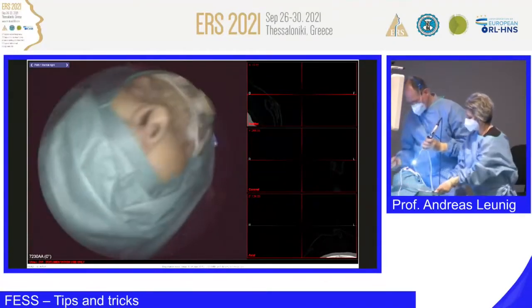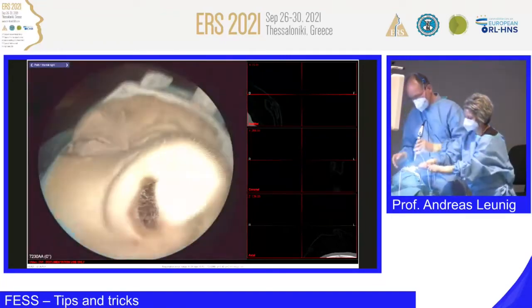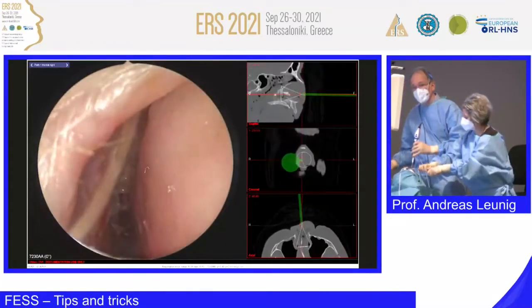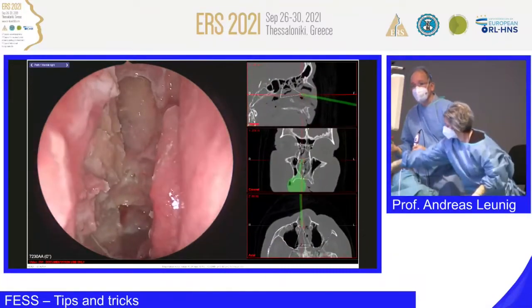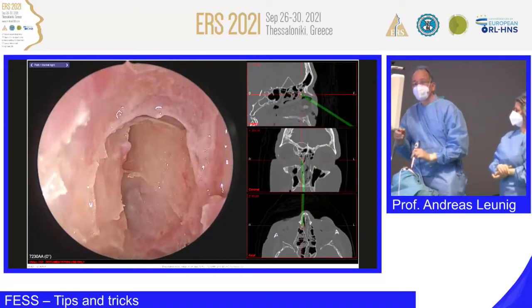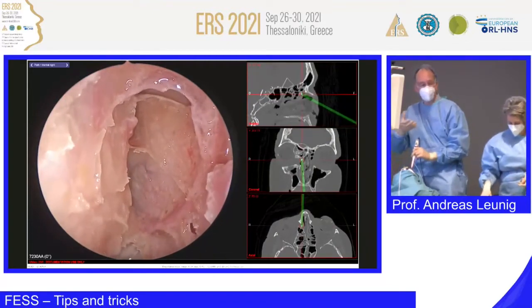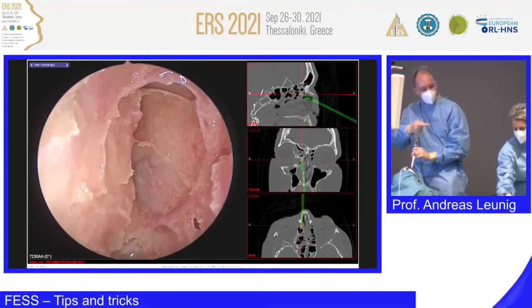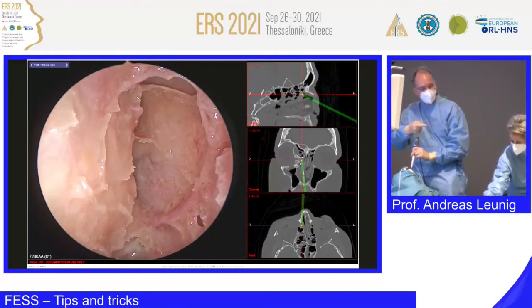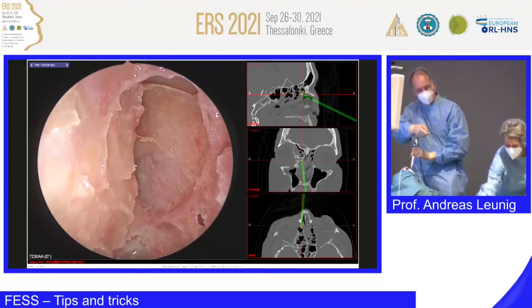And I think this is very nice after you started with the line of sight approach, and then you want to do it more gently, and I am going up here now. And you see there's still the internal beak up there. Give me the punch, I show you how it feels, the circular punch, the upturned one. Yes, maybe we show the Hosemann. No, let's show the Hosemann.